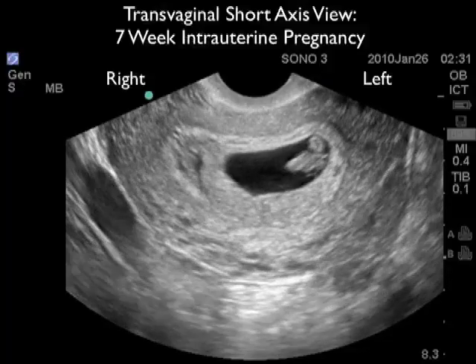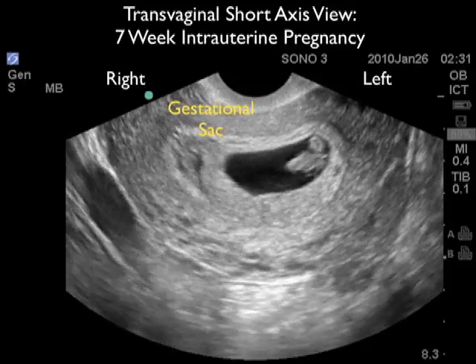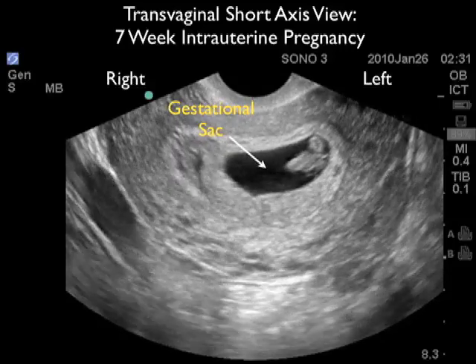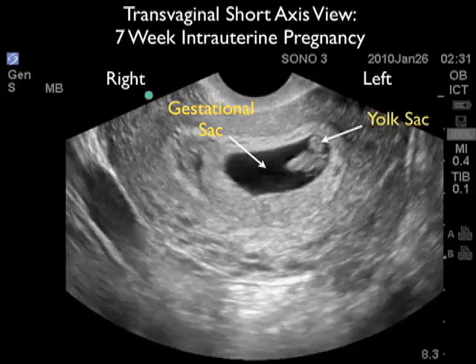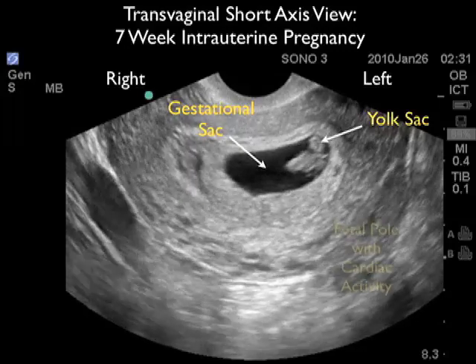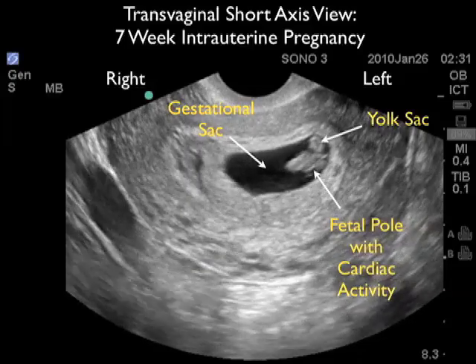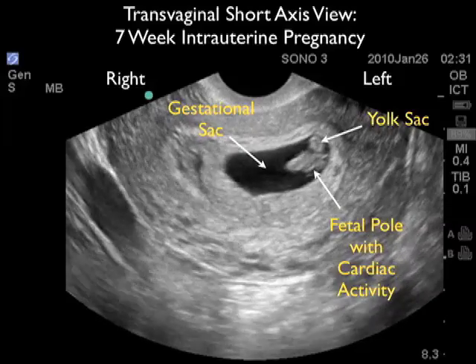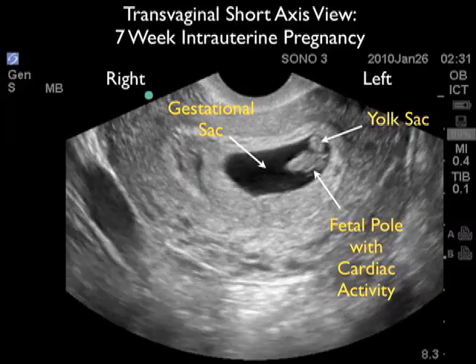Here's a transvaginal short axis view of a 7-week intrauterine pregnancy. The gestational sac is located in the center of the uterus, and there's a good amount of myometrial mantle surrounding the gestational sac, signifying a fundal location. We see the positive cheerio sign, or yolk sac, to the upper right aspect of the gestational sac, and just below we see the fetal pole stretched out. Notice the positive cardiac activity as we scan back and forth through the fetal pole.